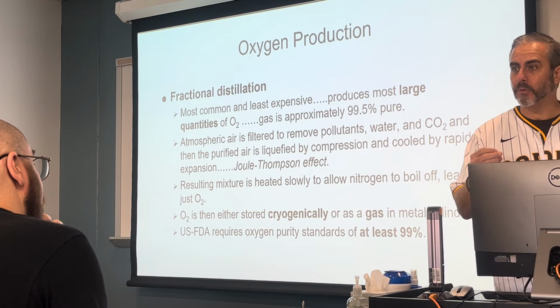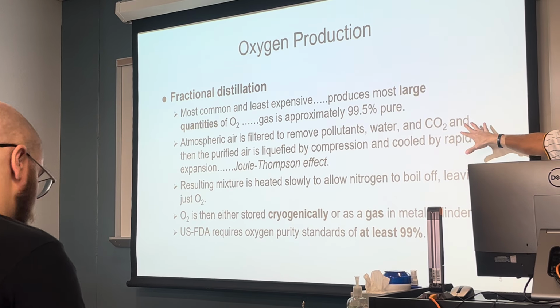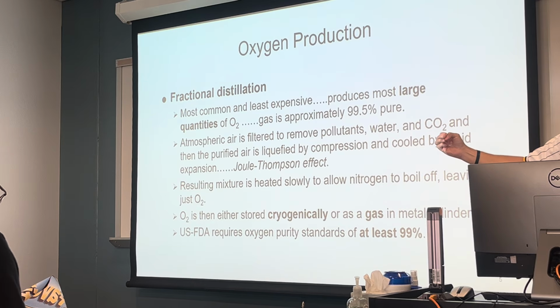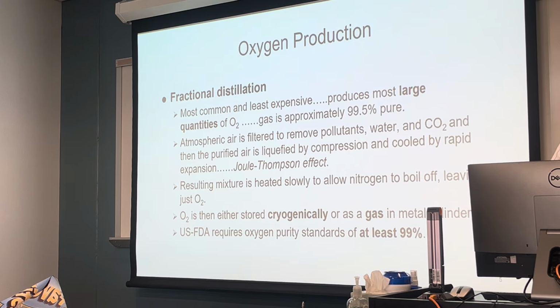Atmospheric air is taken in, and all the other parts and pieces of atmospheric air are removed, leaving oxygen. So we remove the nitrogen, we remove the argon, we remove the other trace gases from regular air, and what we're left with is oxygen.